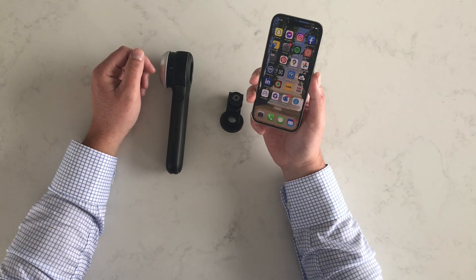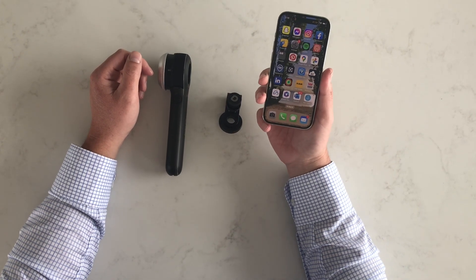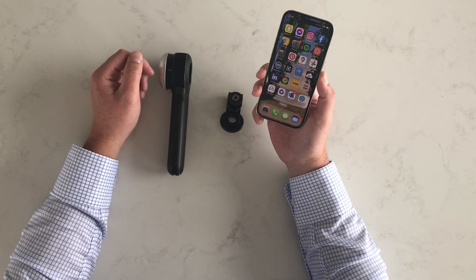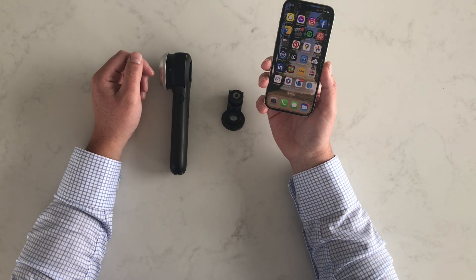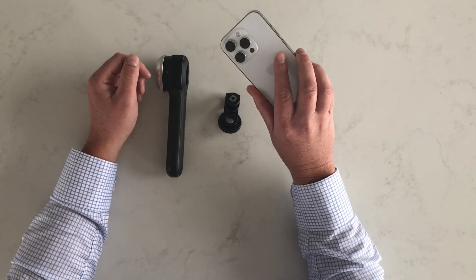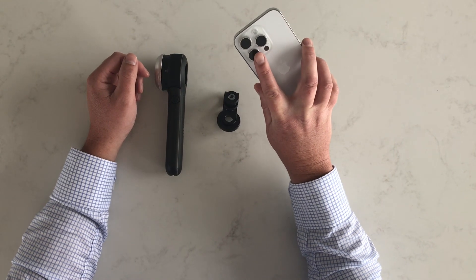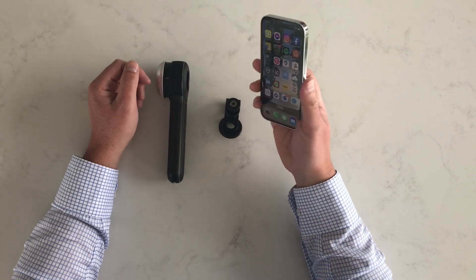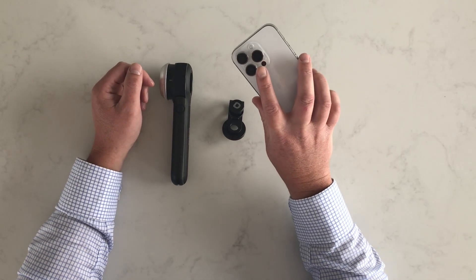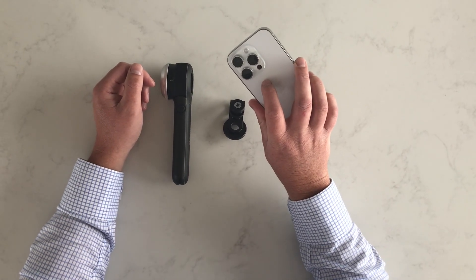Hi, so we just wanted to do a quick video to talk about the connection of dermatoscopes to new iPhones. Historically, you've been able to easily identify the functioning camera simply by putting your finger over the lens. With the new iPhone 14, the main camera actually switches from lens to lens, which makes it really difficult.